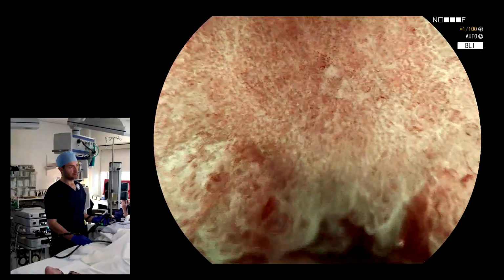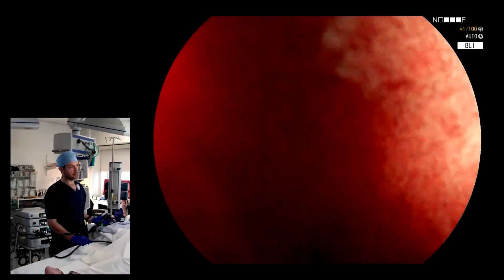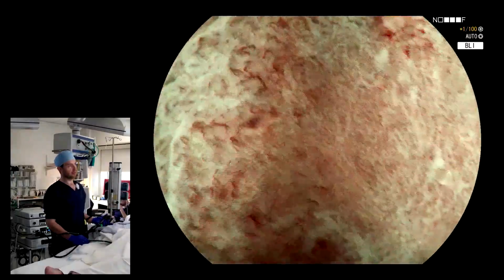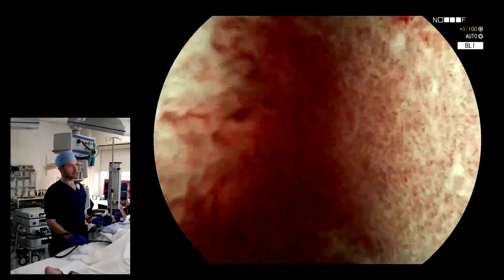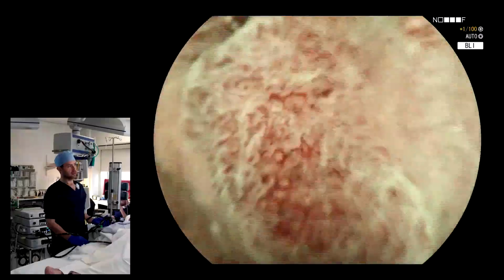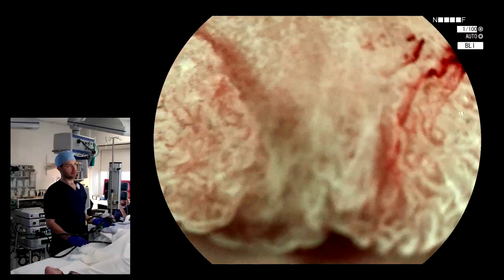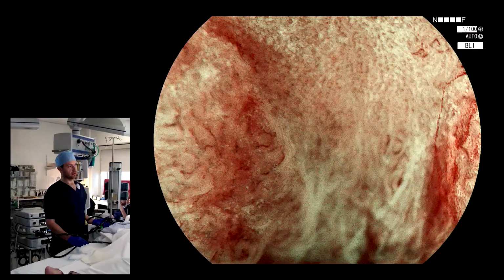Push it away with the water pedal, let it come in, pause it, etc. So water really does add to our ability to visualize this lesion, I think. And here on the edge as well, if you want to freeze it, then we can get some very nice resolution. And then when we go directly in, so now we're at the maximum resolution, you can see what sort of images you can get here.